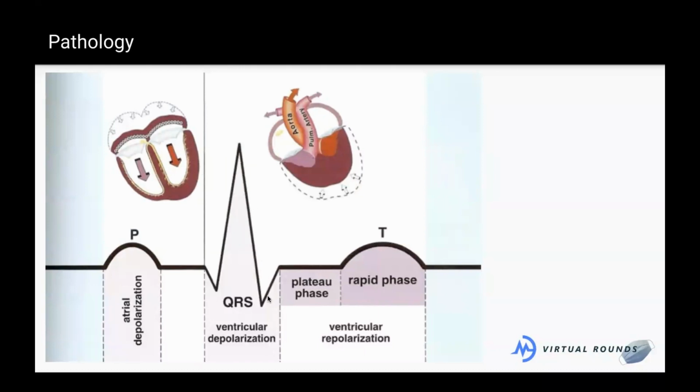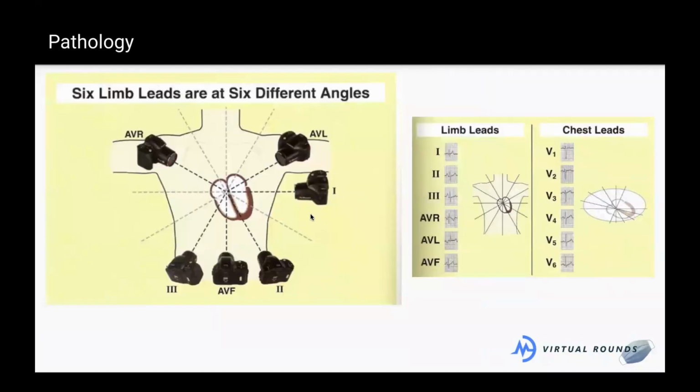I know this is kind of confusing. This is why a lot of people don't like cardiology, because it's a bunch of messy vectors. So this is what I was trying to say. As an EKG, we're basically lead 2 most of the time. Remember how that EKG had a bunch of different lines. We focus mostly on this one. We're mostly lead 2 because this gives us the straightest shot from the SA node down the heart.